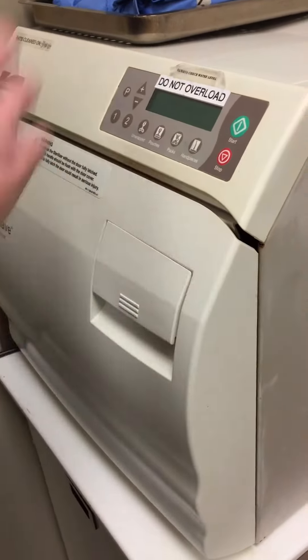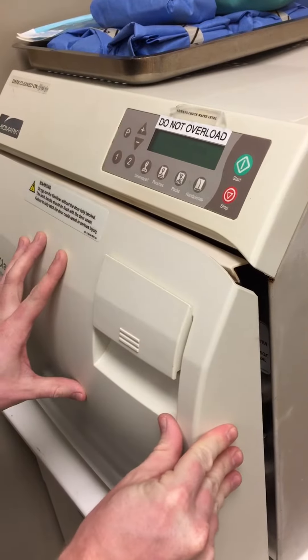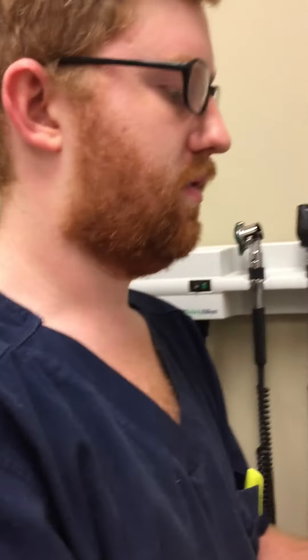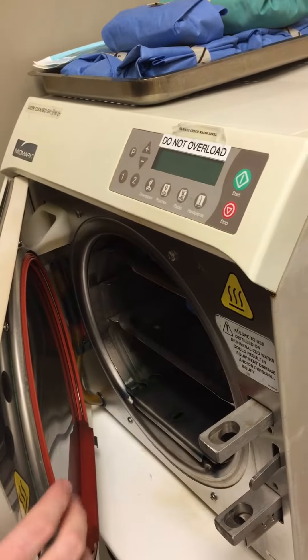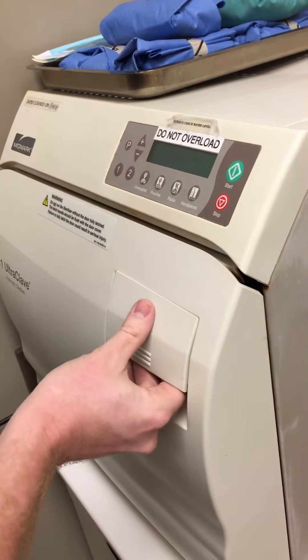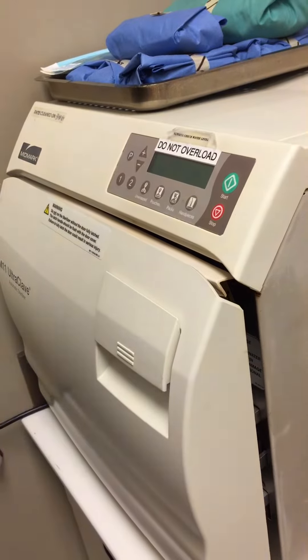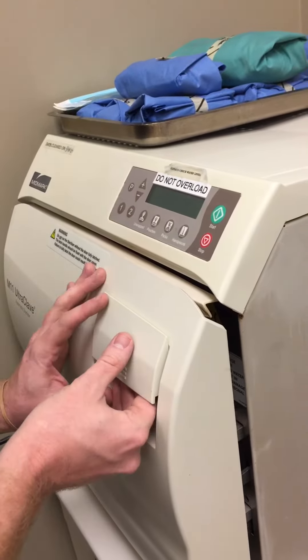After it runs the full cycle, it's going to pop open halfway just like that, allowing the pressure to reduce and the contents to dry completely. It's set up on a timer to do that on its own. If it wasn't like that, you would just mimic the behavior — when it was done, you'd pull it open just a little bit so it can reduce the pressure and allow the contents to dry completely.